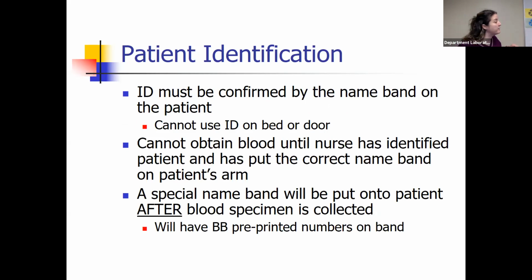Do not use the ID band if it's on the bed or if it's on the patient label on the door, all right? That's not acceptable. Typically, if you're in that situation, definitely contact the nursing staff and say that your patient needs to be appropriately identified.